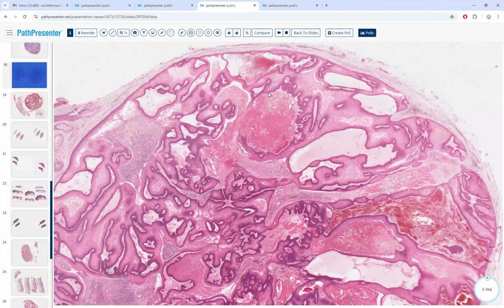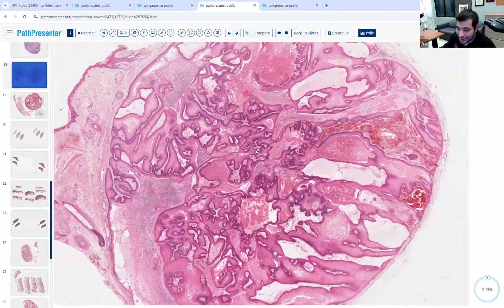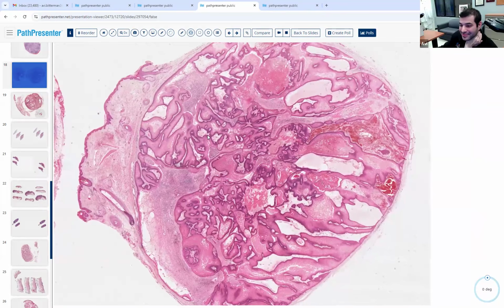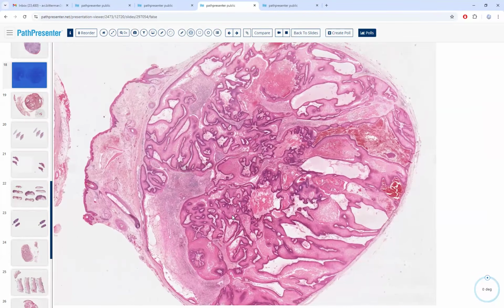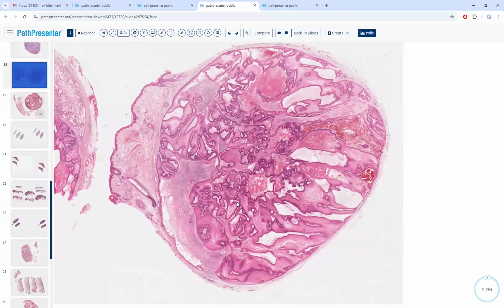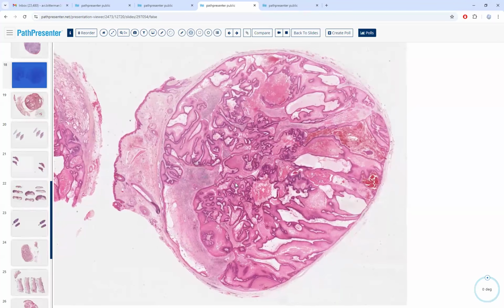Is this rolls and scrolls? Rolls and scrolls. Something like proliferating tricholemmal or pilocyst. Proliferating pilar, or proliferating pilar cyst.